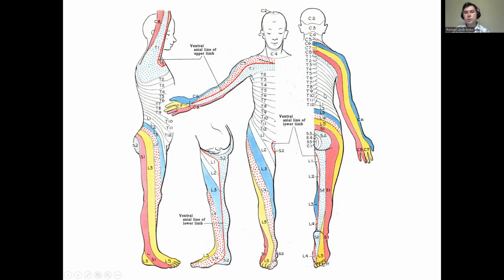And knowing where our problem is located, we may easily find the area of interest on the patient's spine. So we start one vertebra up the area of interest. So assume that our area of interest is C7 to C8. So we start at the upper boundary of C6 and we will finish at T1.